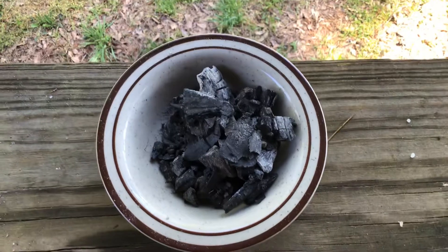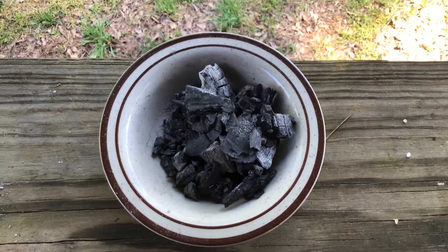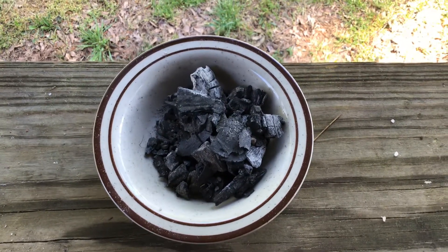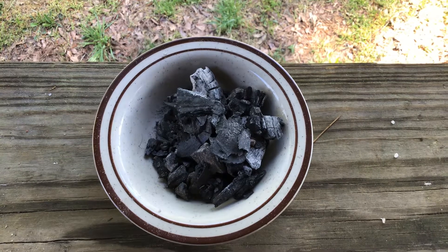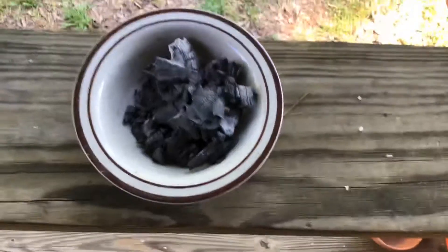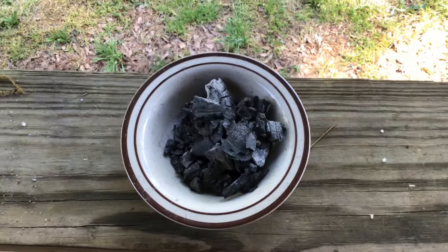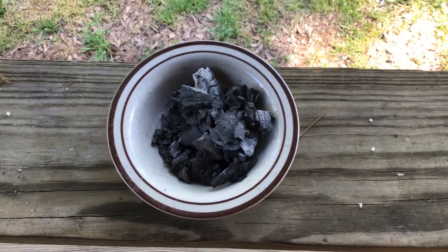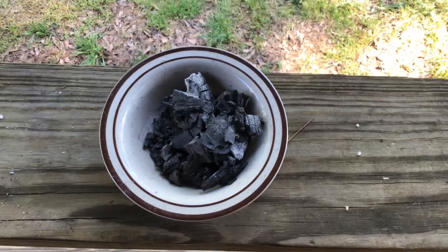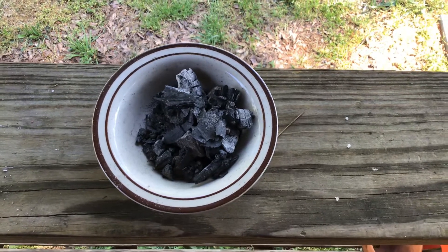This is part two on how to make a COVID-19 air mask from home items. For charcoal, you want the natural stuff — basically either collect it from a fire that you made, or you build a mound around a fire and cap it off to make it into charcoal when you're done.